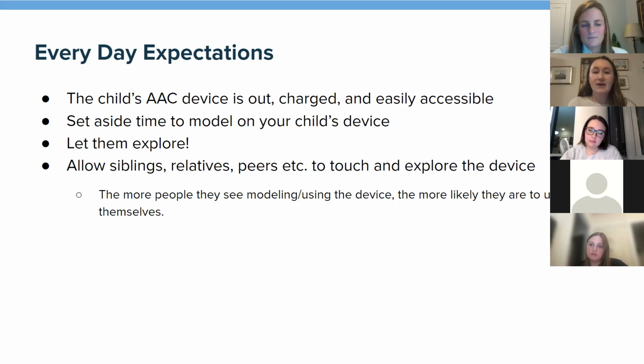And then lastly, allow siblings, relatives, and peers to touch and explore the device. The more people they see modeling and using the device, the more likely they are to use it themselves. Our goal is really to immerse our children in this new form of communication, and a really great way to do that is to have others use the device with them.